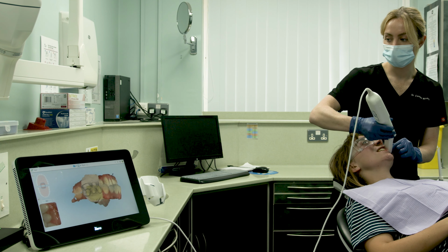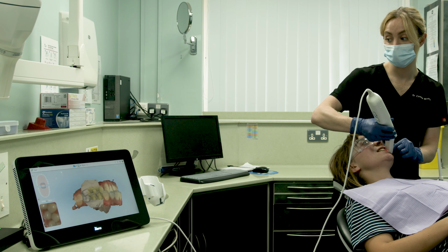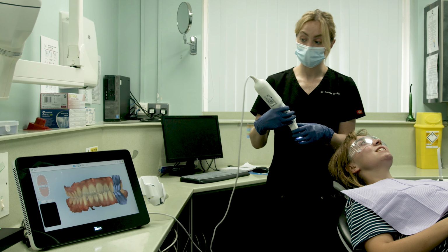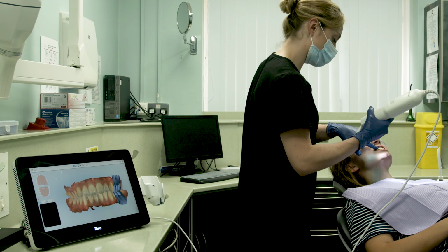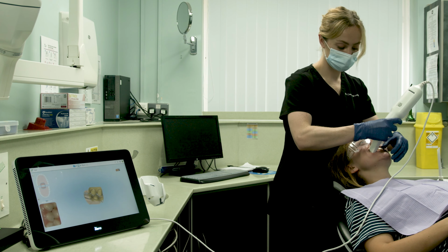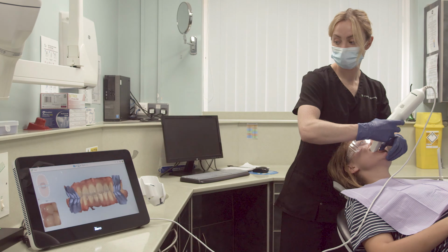And you just move the scanner up and down and you can see that the arches have appeared. That means that the scanner has picked up the occlusion on that side. And then you do the exact same on the other side. So again, just move the lip, pop the scanner in, turn it on, up and down, and it's picked up the arches straight away. So we now have a record of the bite and the occlusion.